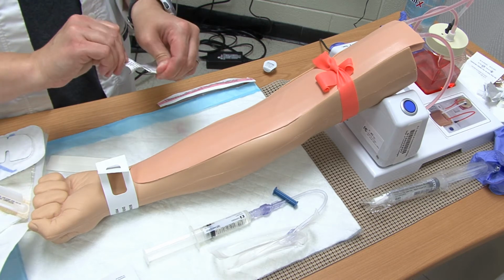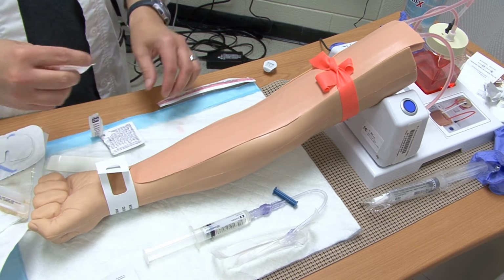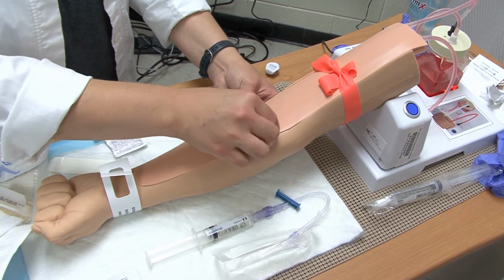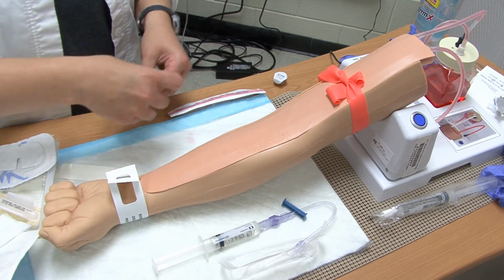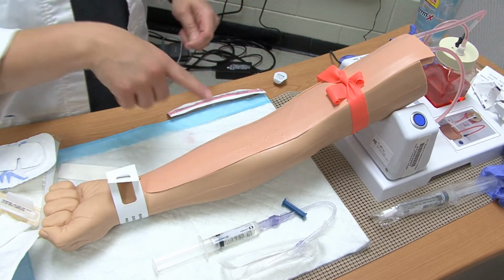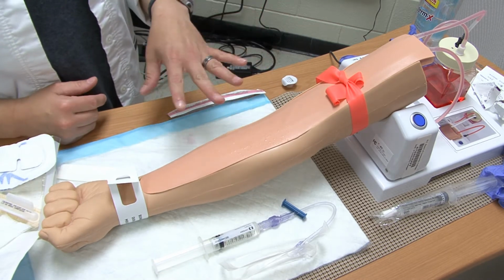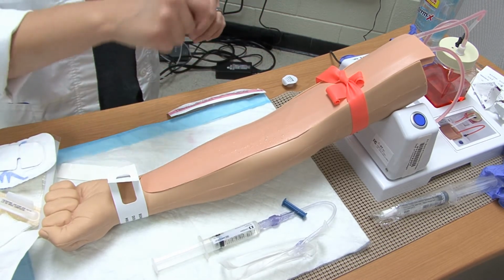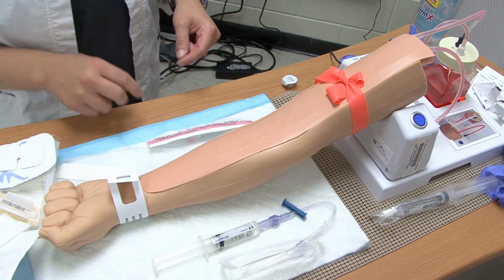Now, when you use it, depending on your agency policy on how you need to clean, most of the time you're going to clean in a zigzag manner. And then you need to let it air dry. I would have cleaned the site for at least 30 seconds and allow it to air dry. If your patient has really fragile skin, it may say that you don't want to do a lot of vigorous scrubbing with it. It kind of depends on the patient's condition.